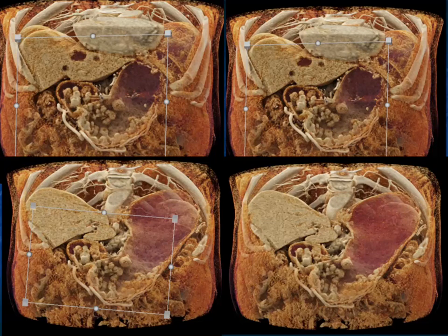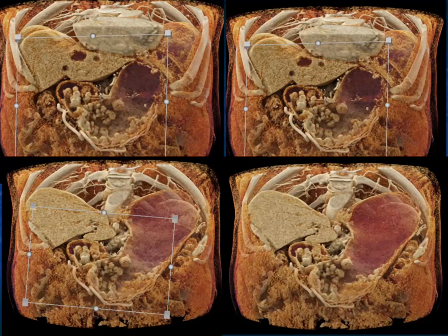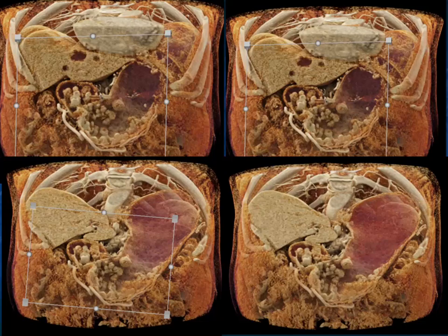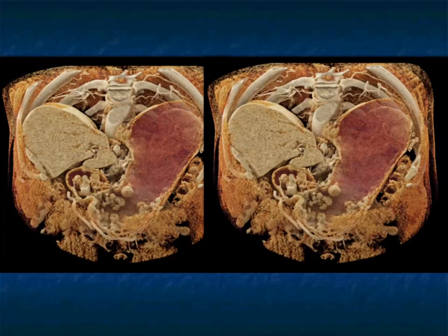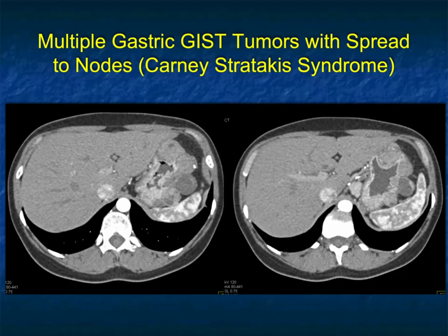Cases like this also emphasize why the stomach needs to be distended in all patients. If the stomach was collapsed, you would probably end up missing all of these polyps.